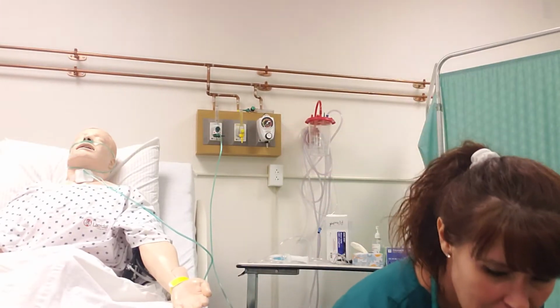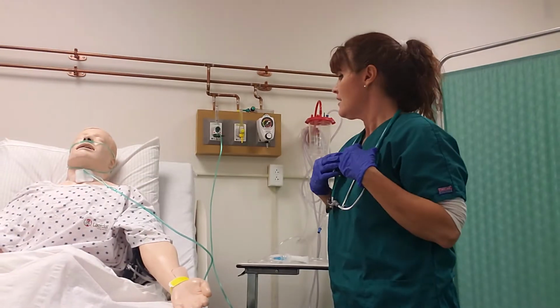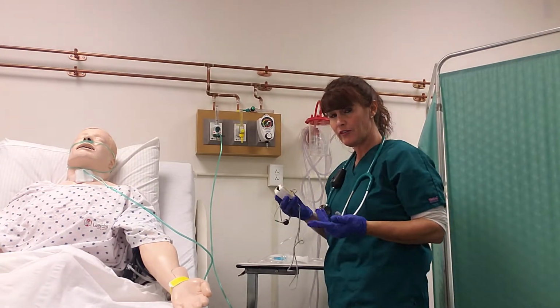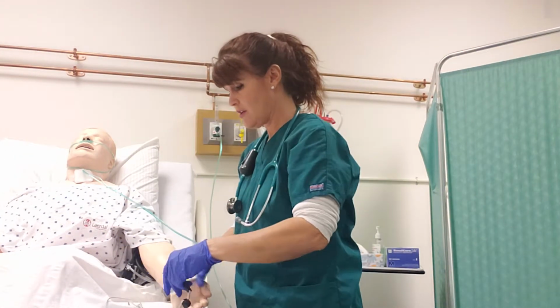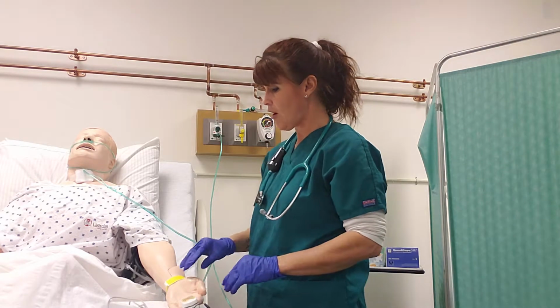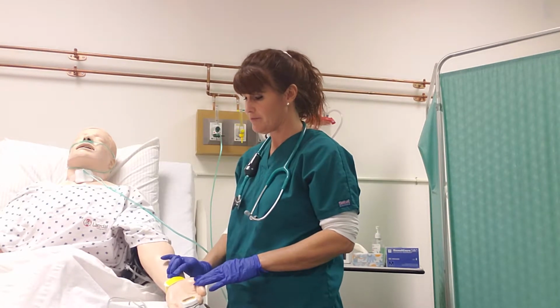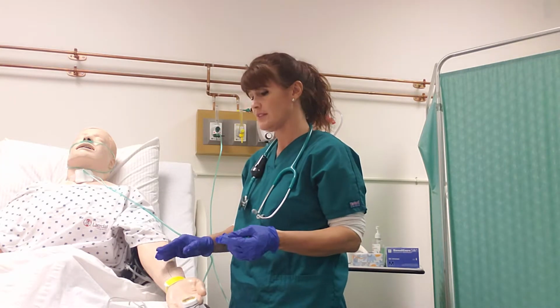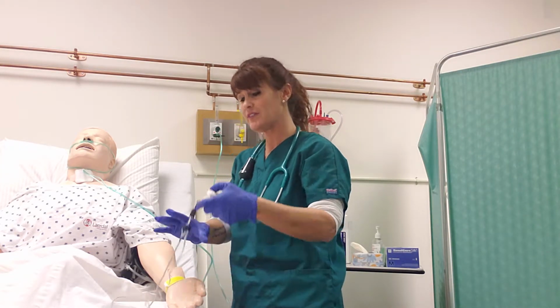So, all right, we've done that. All right, so now we're going to check the patient again. We're going to check his SpO2 levels, see if they've gotten better. Again, we're going to do the heart rate and the respiratory rate. Like I said, you can watch for 15 seconds, multiply by 4. Okay, so we're going to pretend we've done all that.